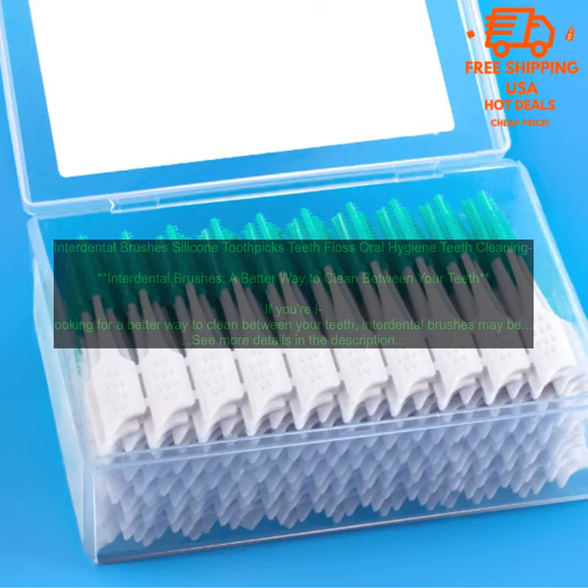Interdental brushes are a great way to improve your oral hygiene and prevent gum disease. They're also a good option for people who have braces or other dental appliances.